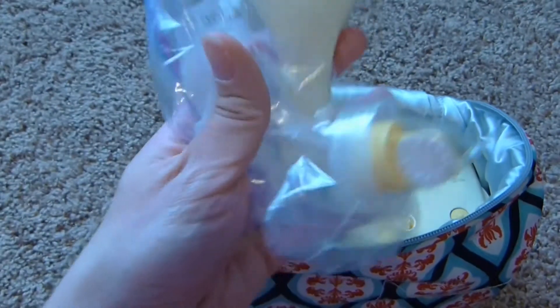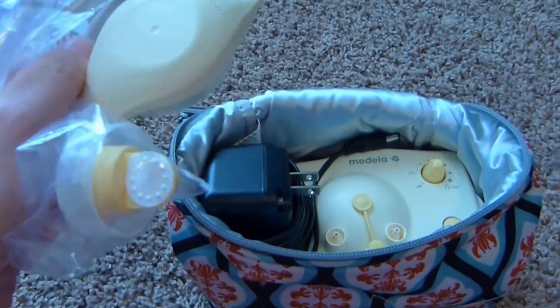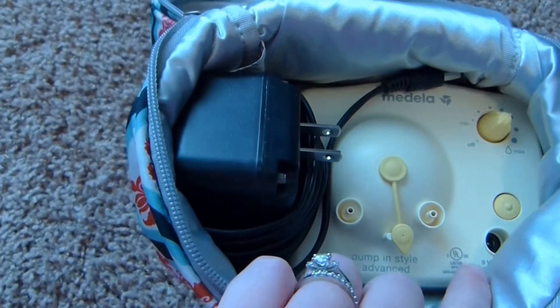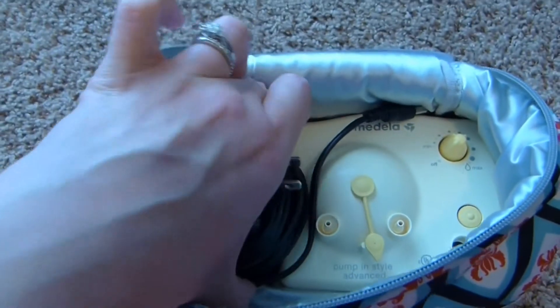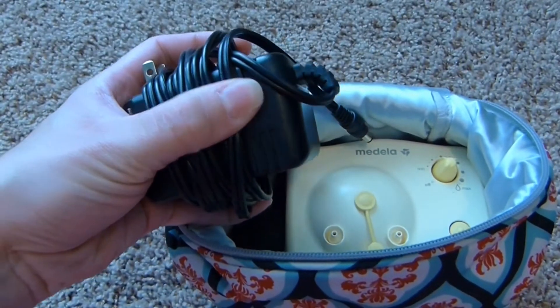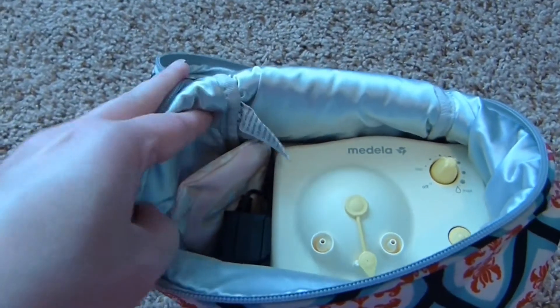This is just the manual parts in case I need it — the manual pump and the flange that goes with it. That's my just-in-case; I don't normally use that. Here's my Pump and Style Advance, the actual pump part. Next to it I keep the AC adapter in case I'm somewhere with a plug, though at work I actually usually have to use the battery pack.